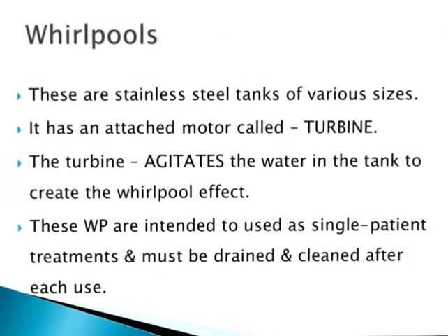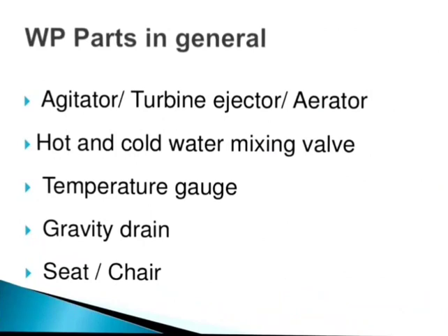Now Whirlpools, these are stainless steel tanks of various sizes, and there is an attached motor which is called a turbine. So this turbine agitates the water in the tank to create the Whirlpool effect. These Whirlpools are intended to be used as single patient treatment, and they must be drained and cleaned after every use.